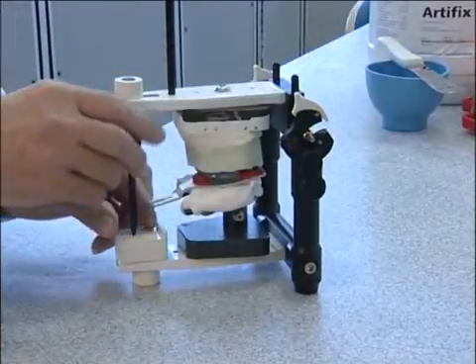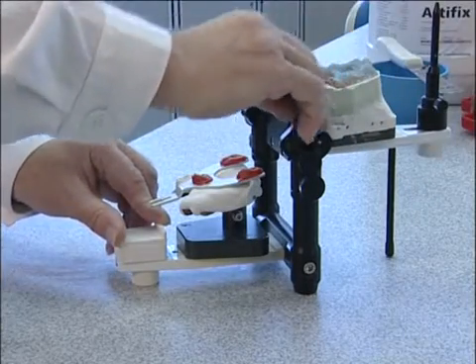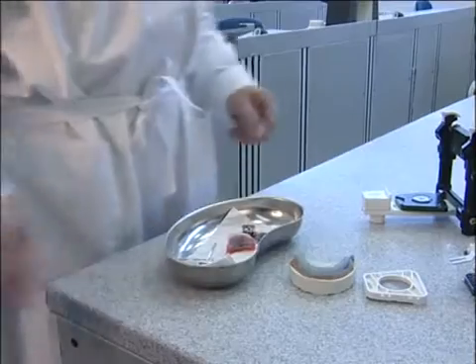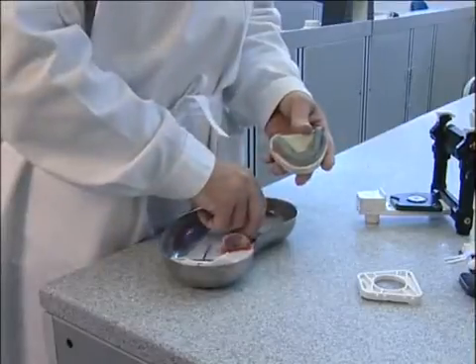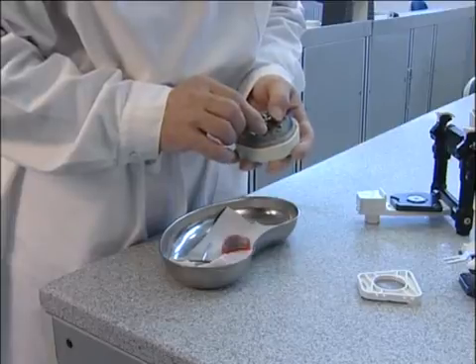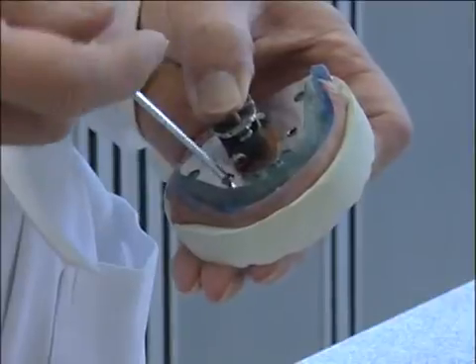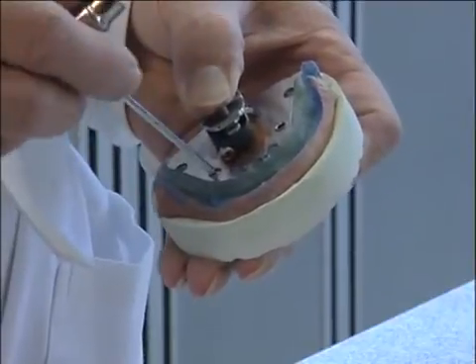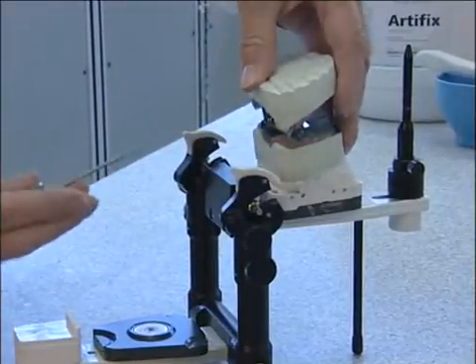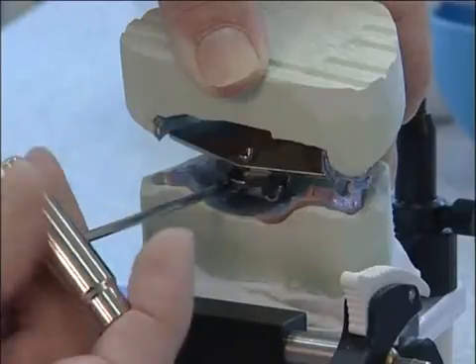First, the centric lock is opened to allow the model to be released dorsally from the indentations in the bite fork. Then the articulator is locked again. The SplitX transfer stand is removed. The tracing plate of the CentroFix registration is then screwed to the lower model. And the pin holder to the upper model. The jaws are now in the correct centric relationship.